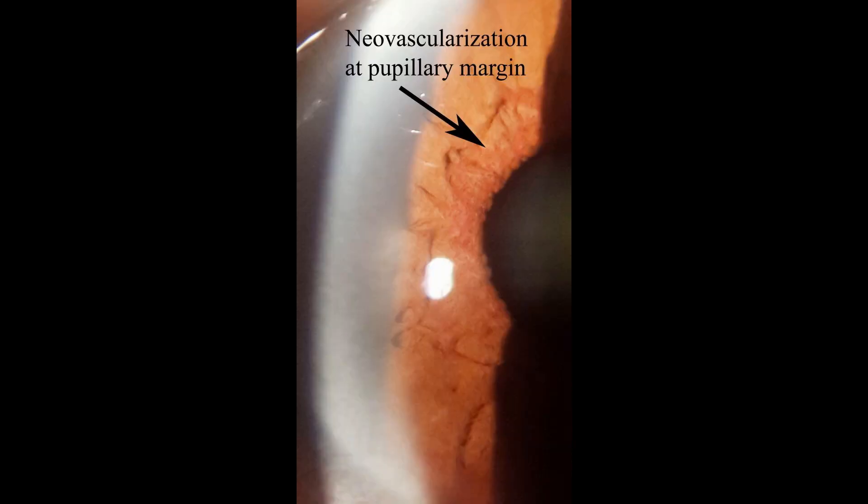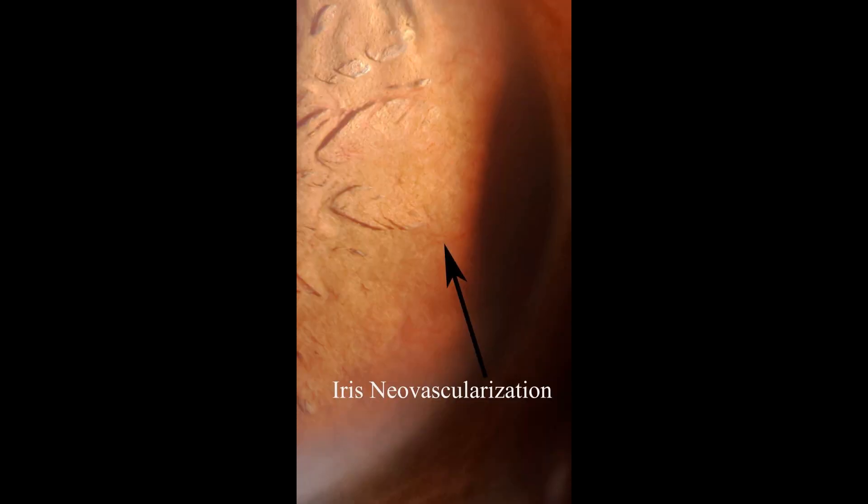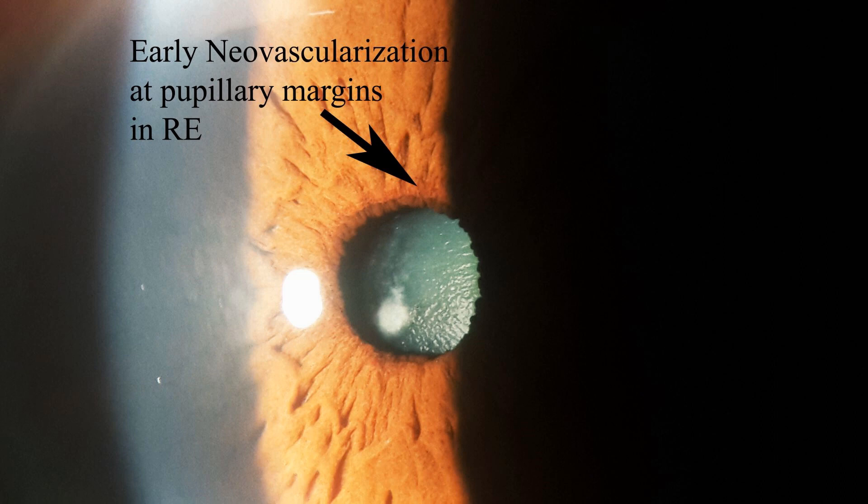Here is a patient with persistent hyaloid artery. In this gonioscopy video, the ciliary processes are clearly made out through the dialysis in a patient with angle recession and iridodialysis following blunt trauma. This is a patient with neovascular glaucoma. Neovascularization of the pupillary margin is evident in this photograph taken with the smartphone. Gonioscopy video shows open angle with new vessel in the angle and couple of goniocysts.